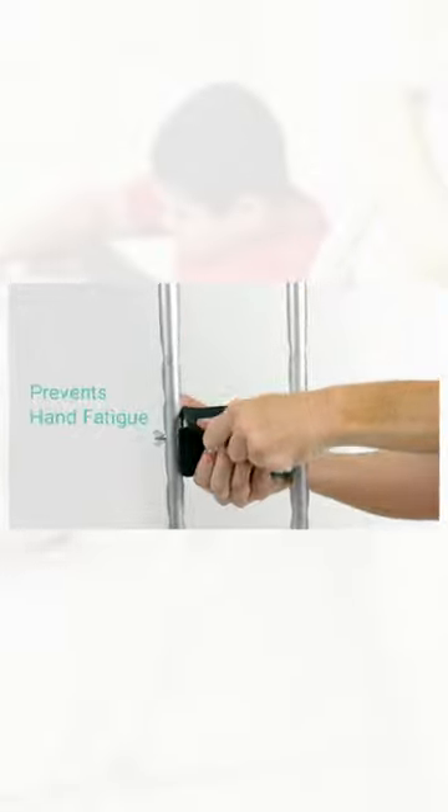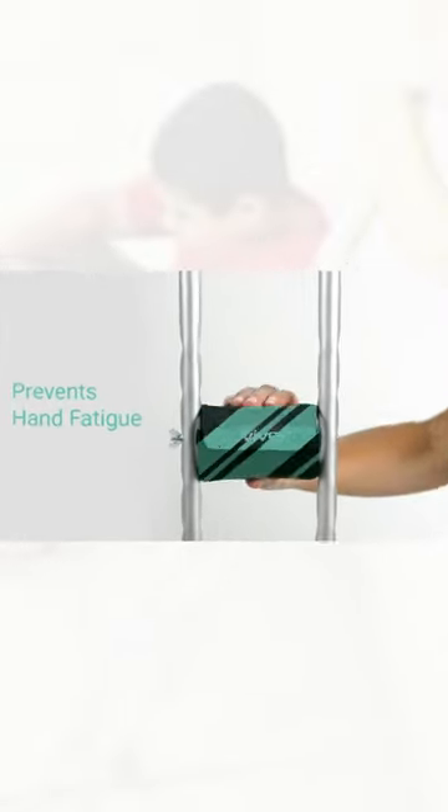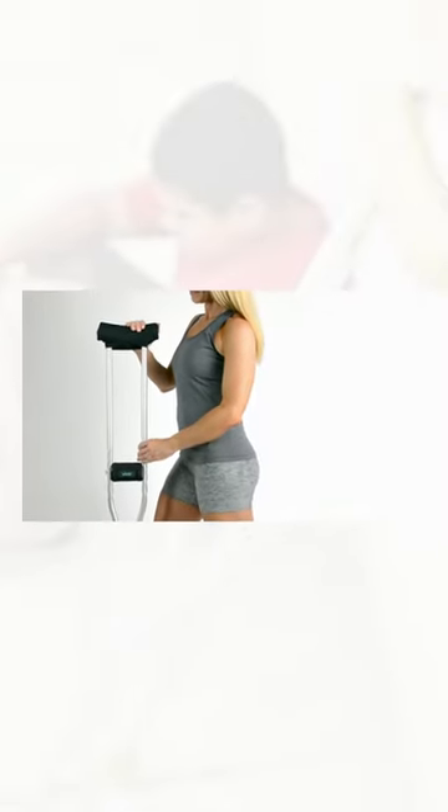Every set of pads comes with an additional set of leather-covered hand grips to prevent hand fatigue. You can't beat that anywhere. So confidently order your crutch pads now for all-day comfort.